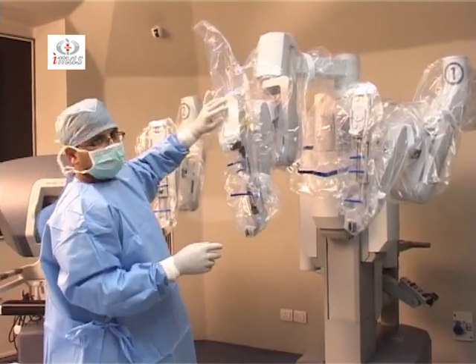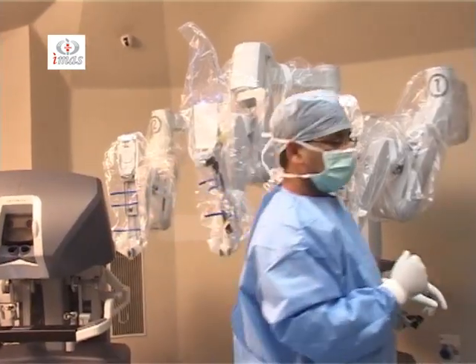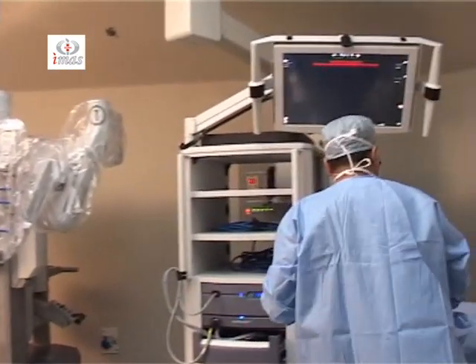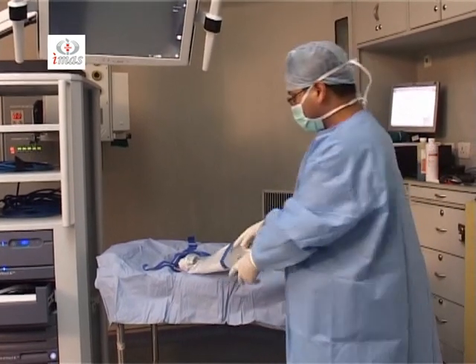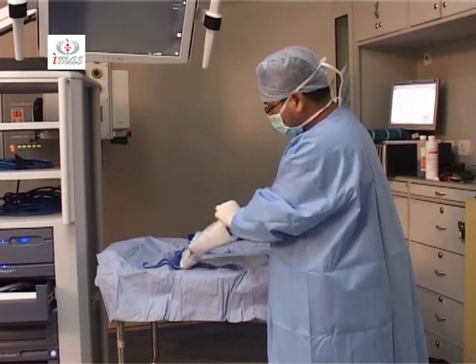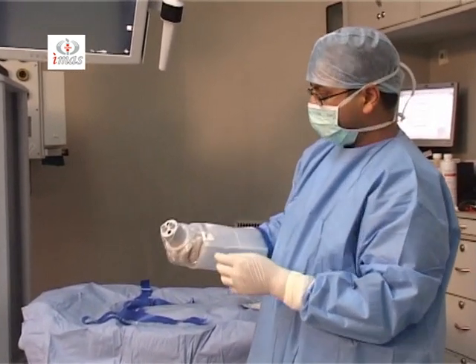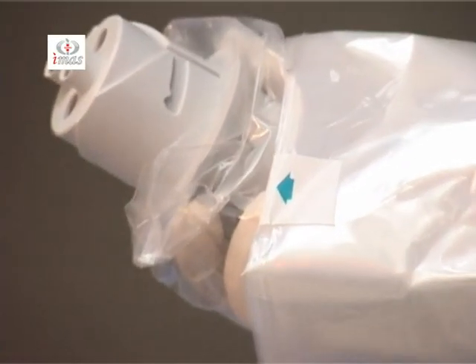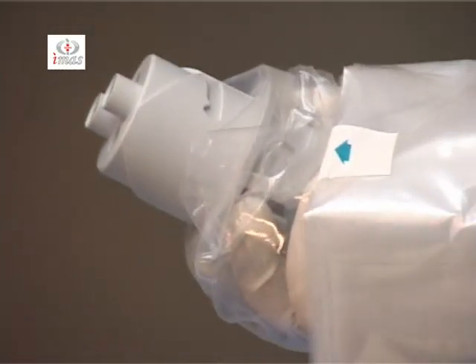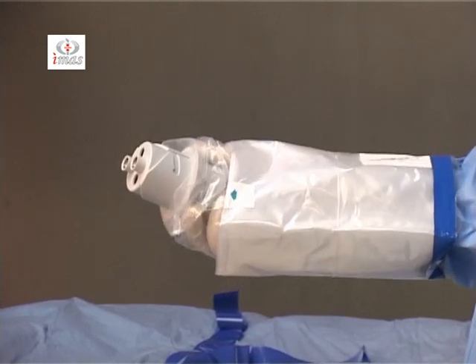So now this provides a sterile interface to put the instruments onto the robotic arm. So this is the camera head drape, which is used to drape the camera head. You have to insert your hand inside it and hold the sterile adapter, and an unsterile person will hold the camera head. Mr. Hemant Rathi is assisting me in draping the camera now.